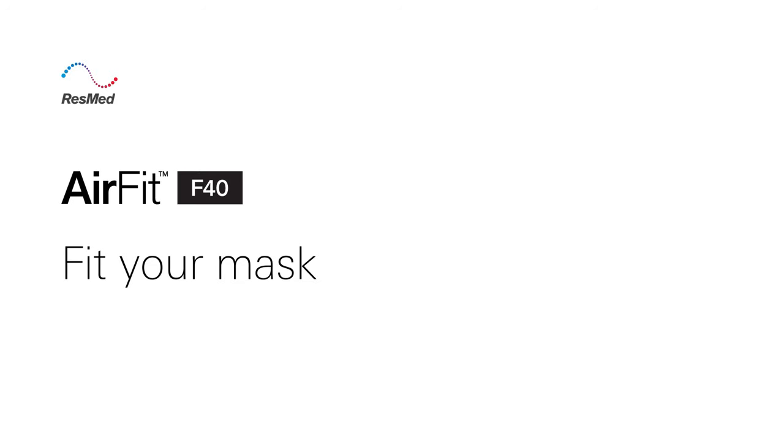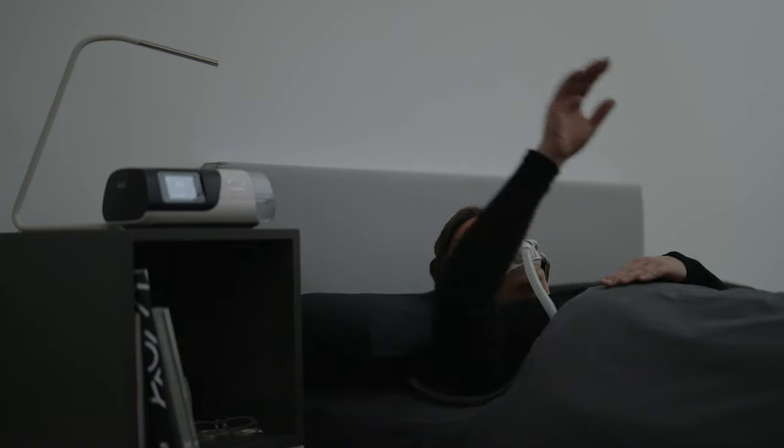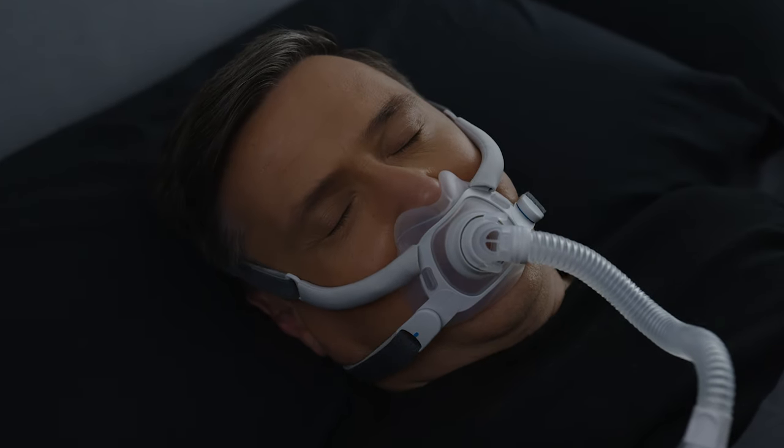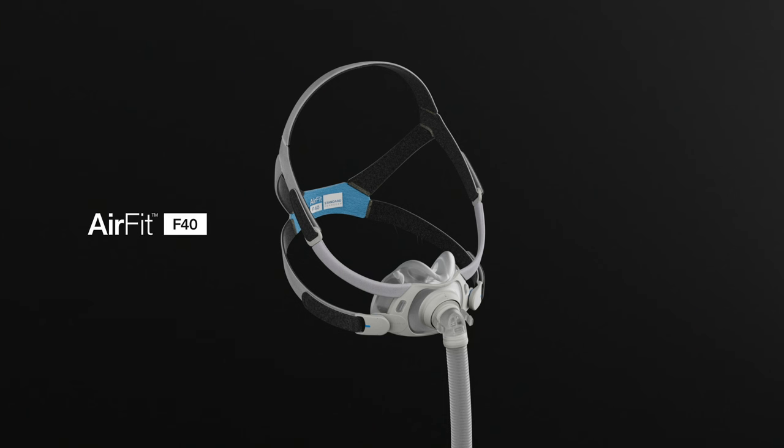In this video, we'll show you how to correctly fit your AirFit F40 full face mask. Let's get familiar with your AirFit F40 full face mask.